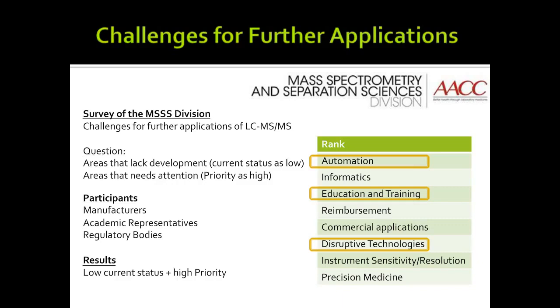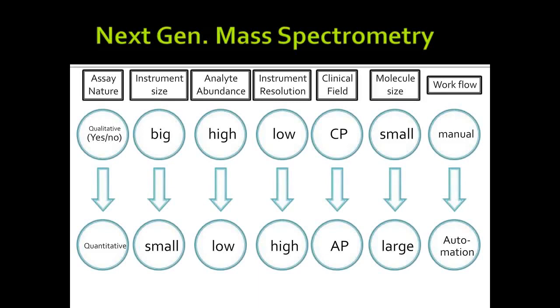All right, to put them in a different way, this is what I think about. We have talked about the challenges, and now we want to talk about the opportunities. If we talk about the next generation clinical mass spec, what areas do we want to think about? As you can see, this is a relatively busy slide, with a lot of areas that need attention and can be further developed. So let me go through briefly some of the elements.